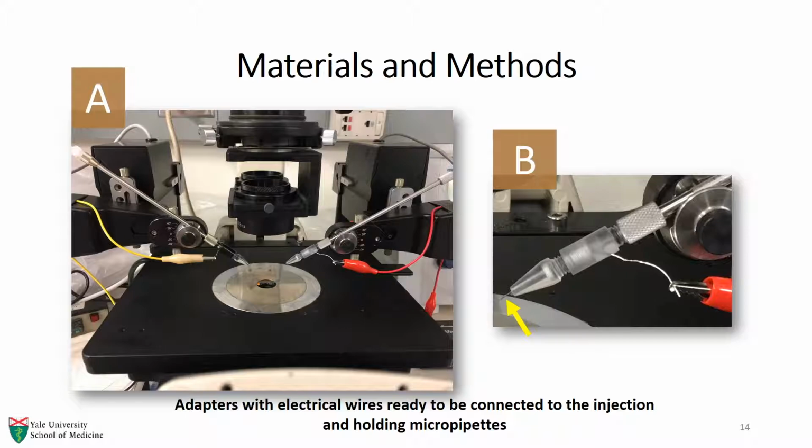Picture A shows the adapters integrated into the pipette holders. The yellow arrow in picture B points to the portion of the electrical wire that is going to be inserted into the glass micropipettes, ICSI or holding.